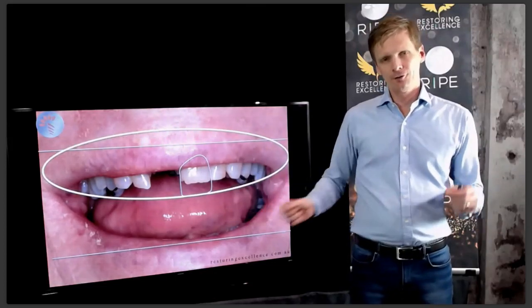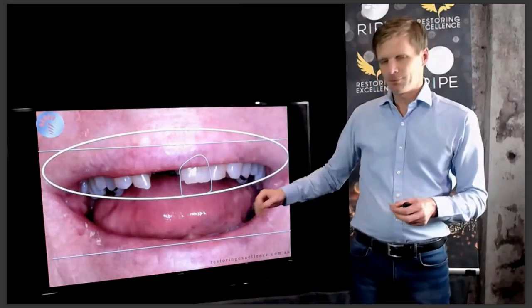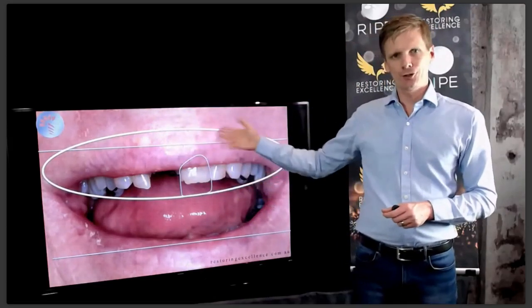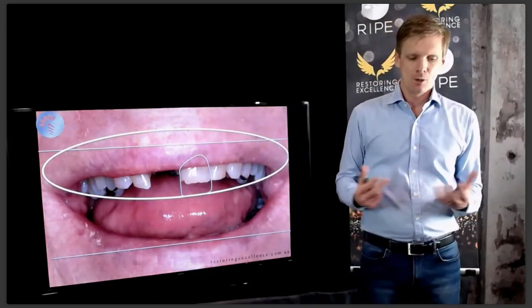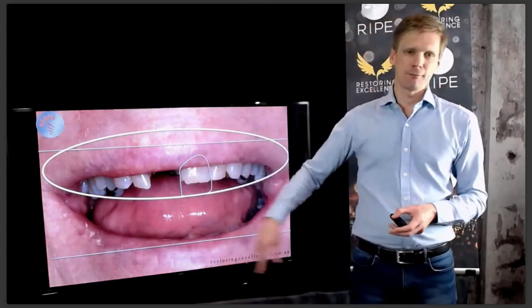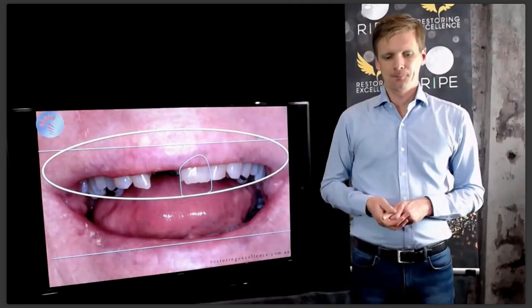I used the circle shape, and you just stretch it out until it looks like a smile curve. Obviously not the top bit, we're not worried, but using the full circle shape gives us a smile curve that will follow the lower lip or where we think the smile should be. So in this case, I've just drawn in here using one of the drawing programs where I think a tooth should be. How much tooth?